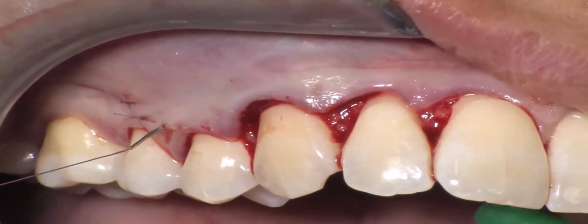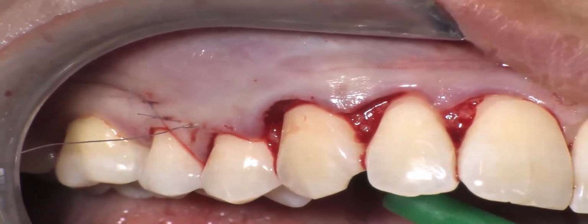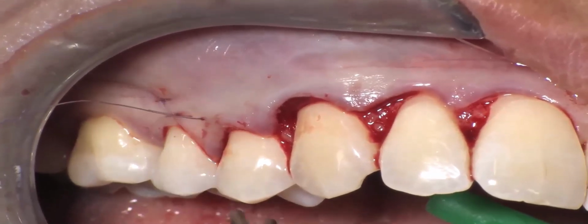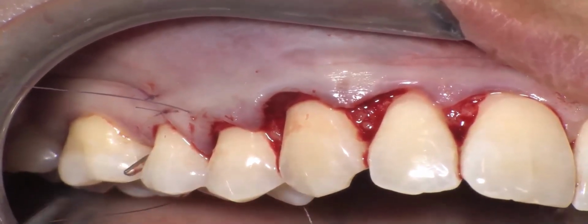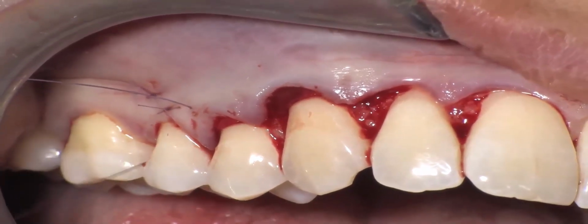Now the papilla is right in the position, and thanks to the closure of the vertical releasing incision first, give anchorage distal, as I told you before.